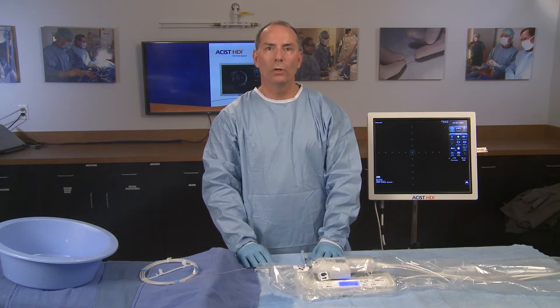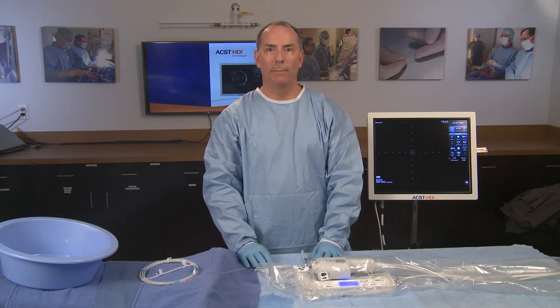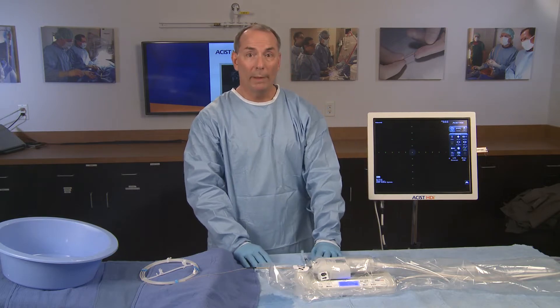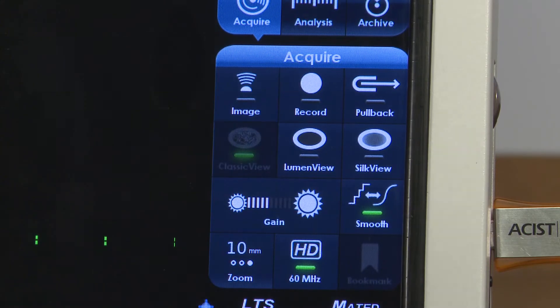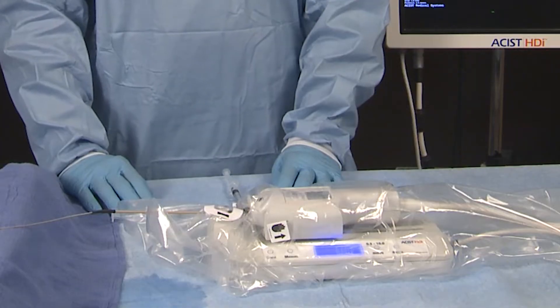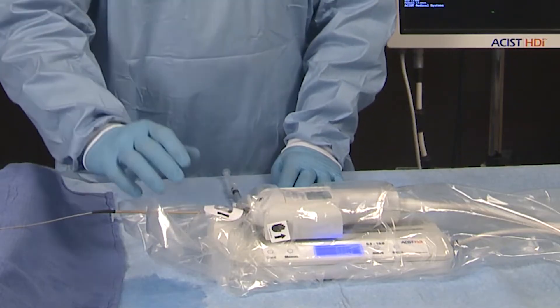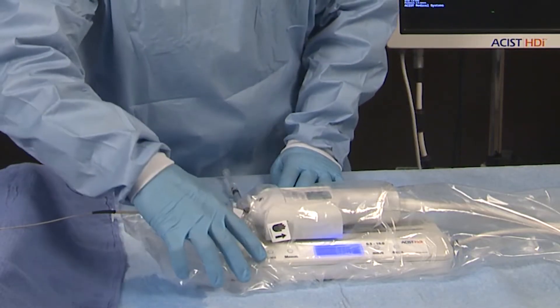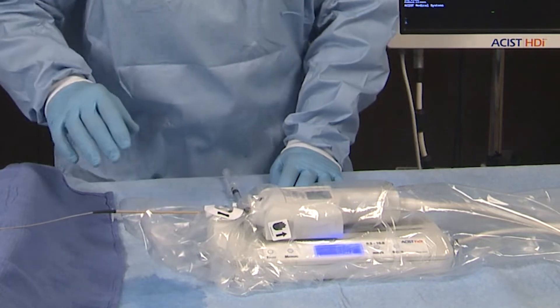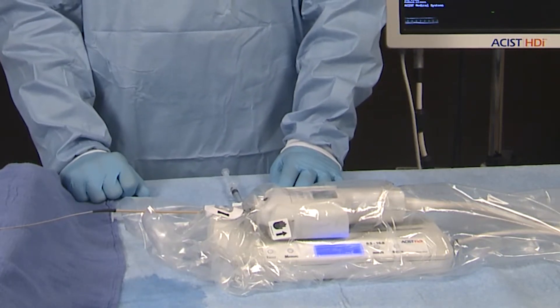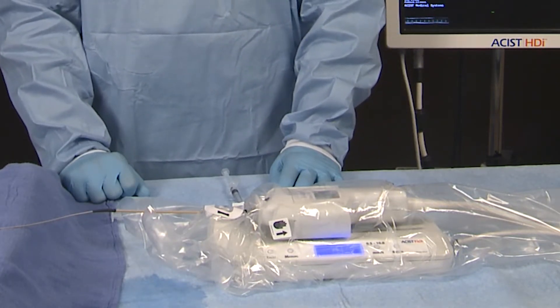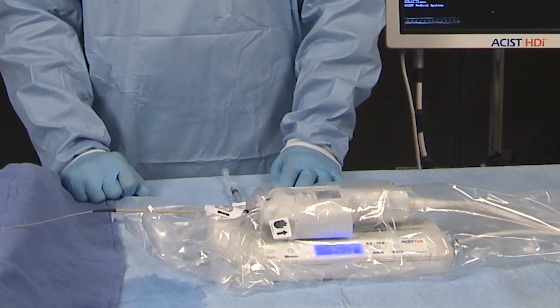To start recording while using the PIM and LTS, press pullback on the console or press the start button on the LTS. A green light on the pullback button illuminates when pullback is activated.